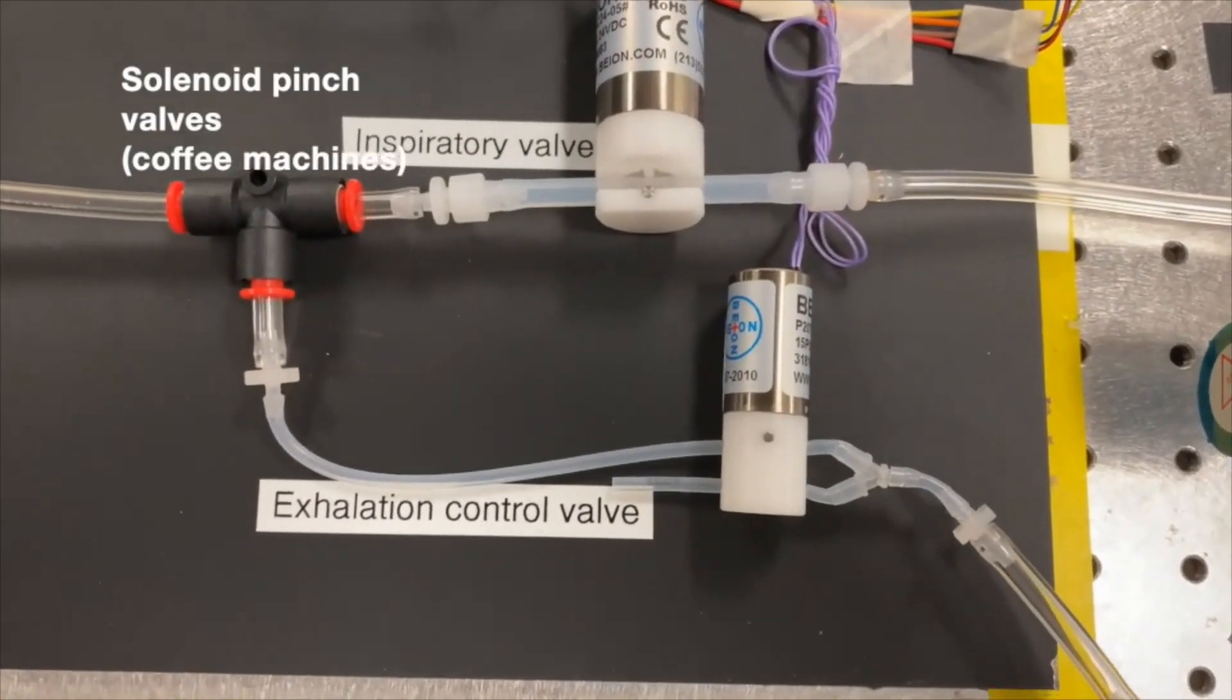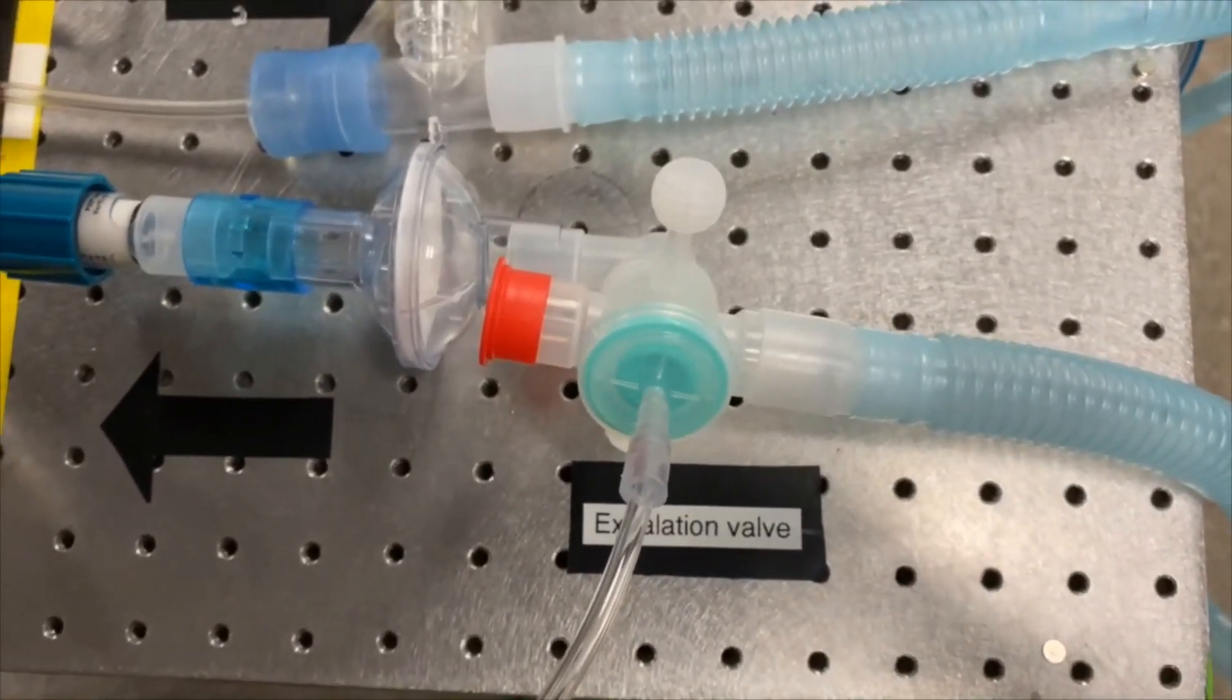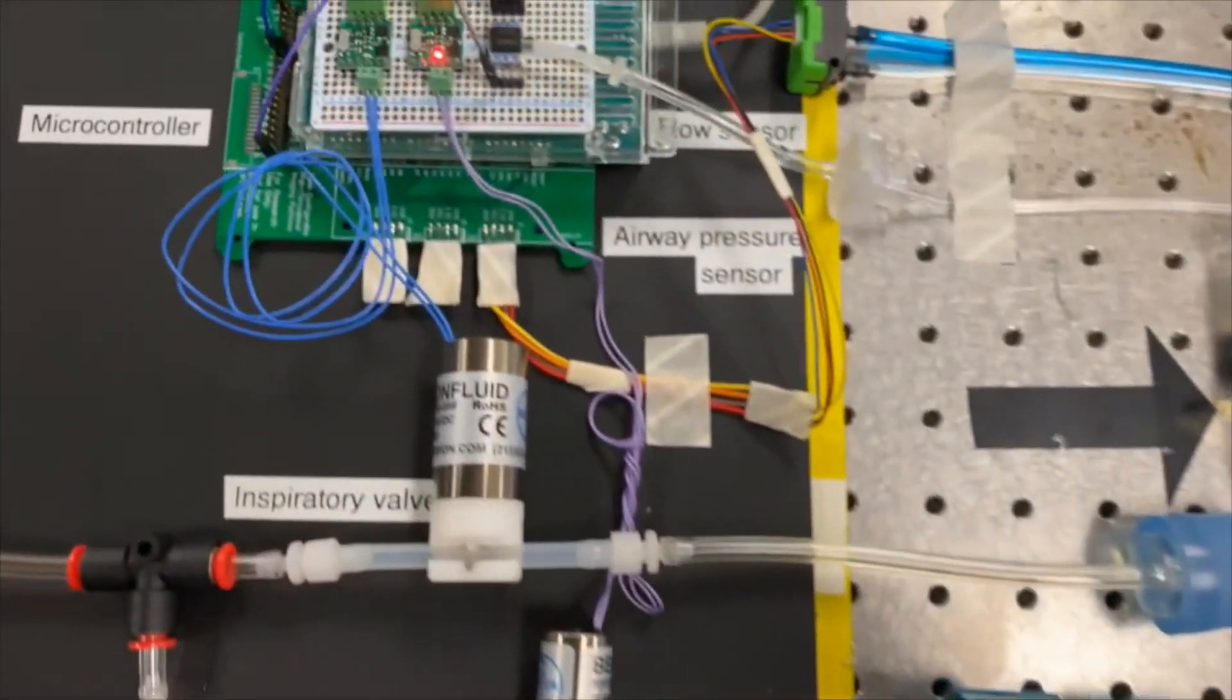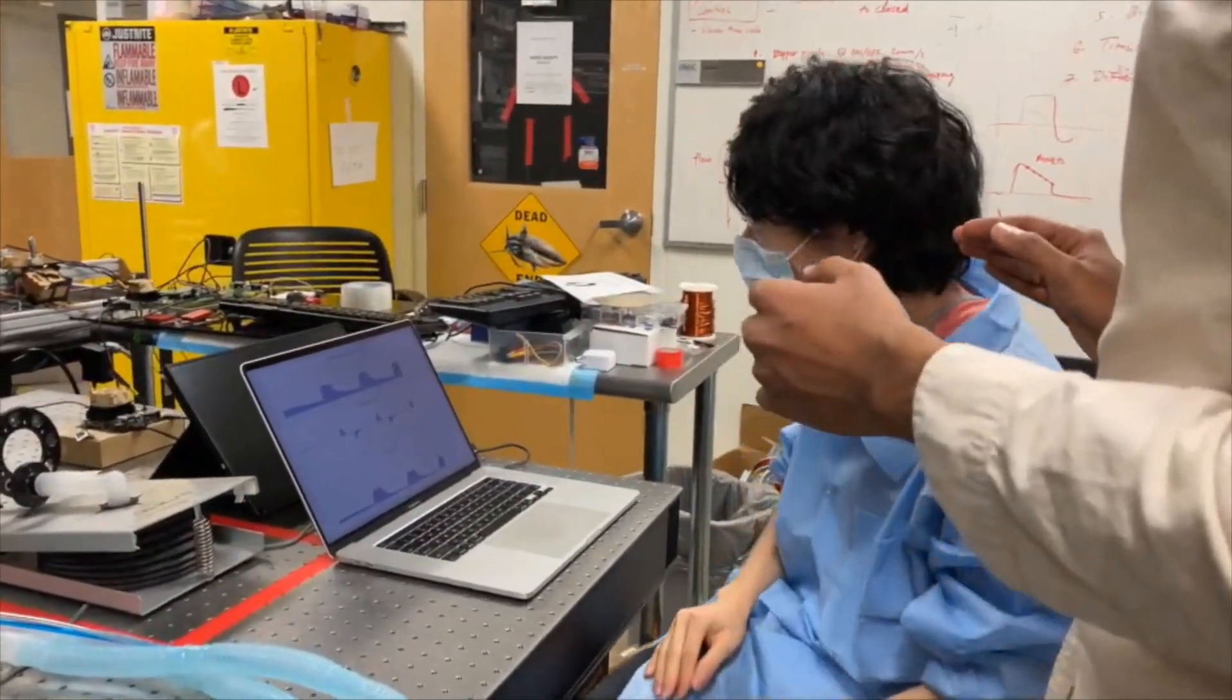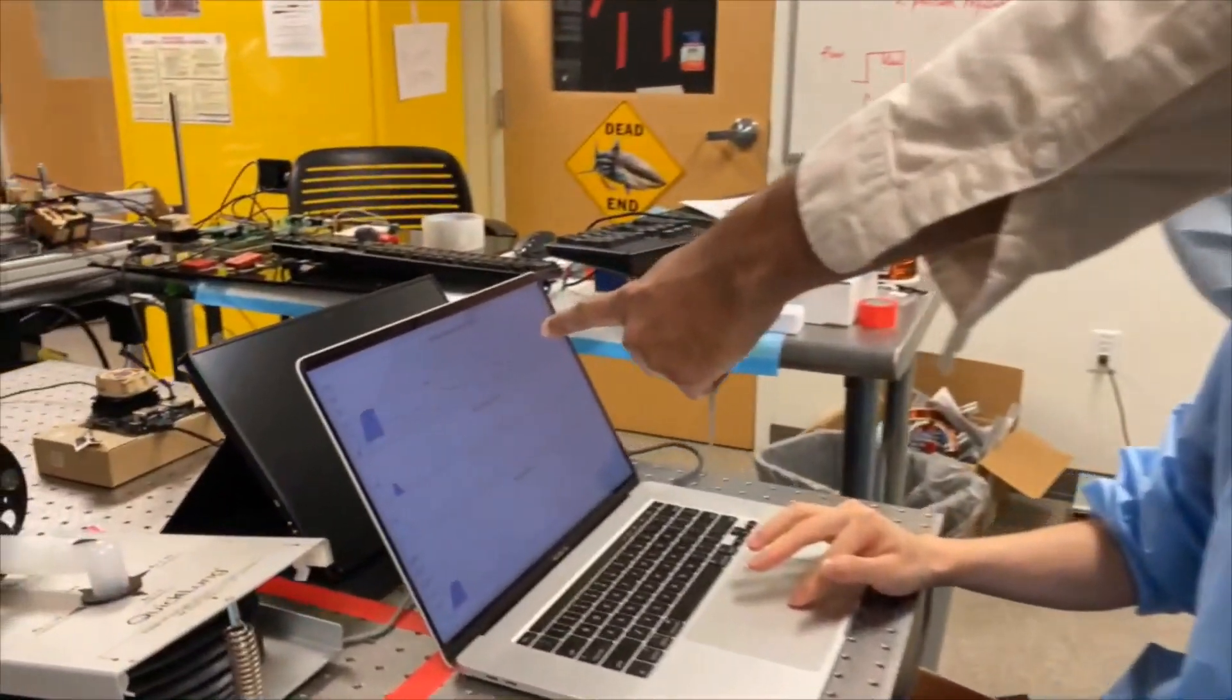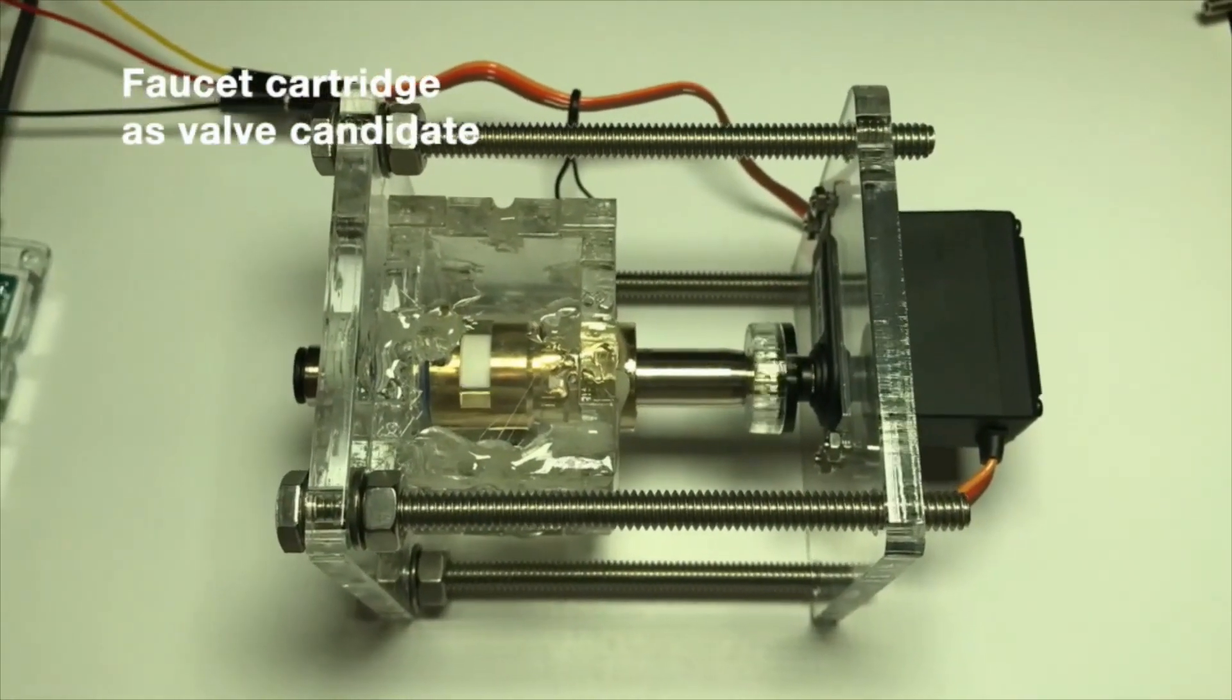As a group who thinks about frugal science, we started looking at what other industries might have parts that we could build ventilators out of. An inspiration struck when we realized that we could borrow parts from automated coffee machines, the actuators that go into moving your car seat, all the way to the faucet valves that go inside whenever you turn the water in your basin on and off.